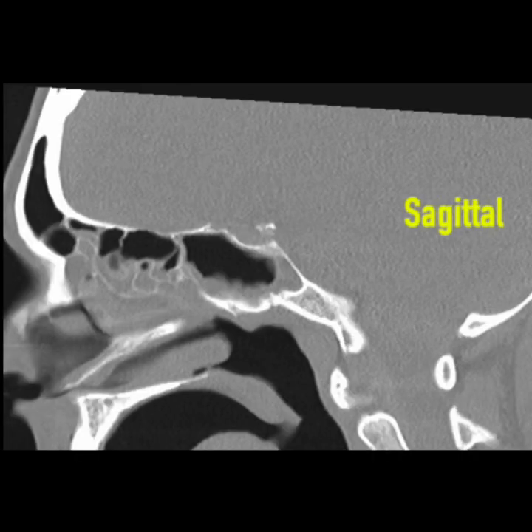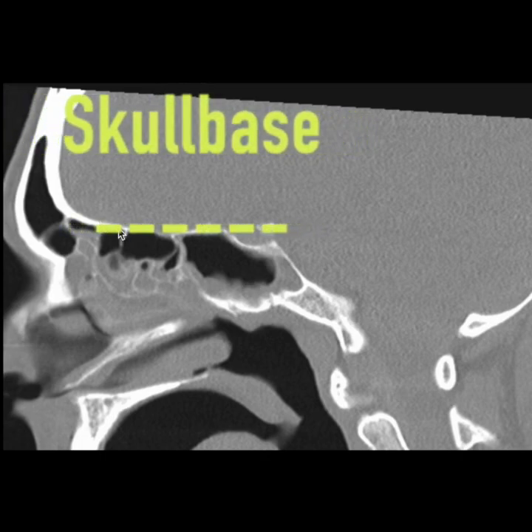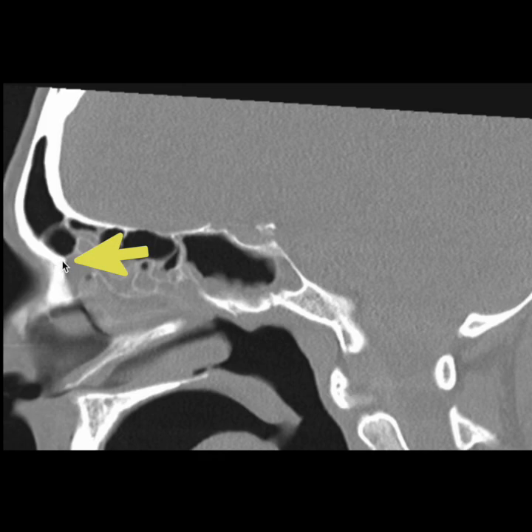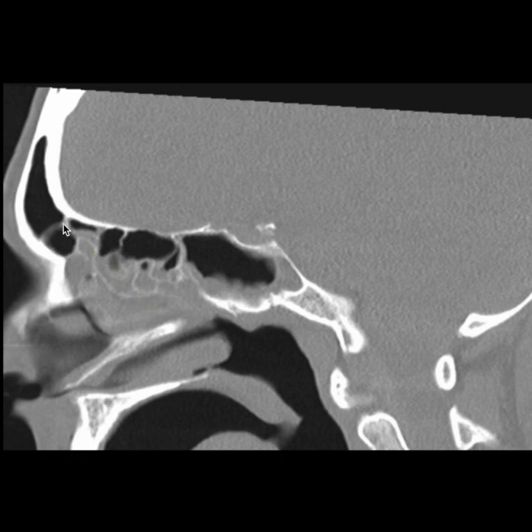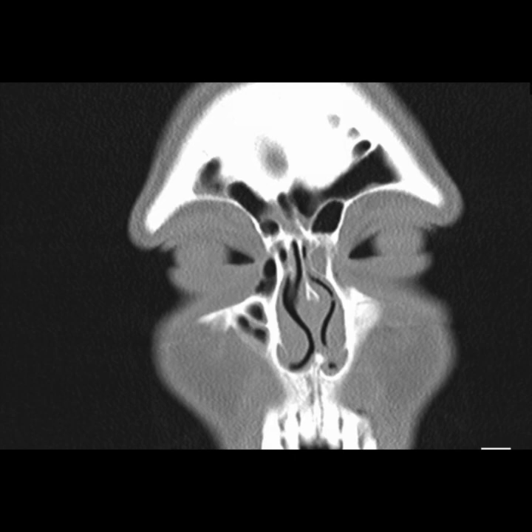This is the sagittal section, which is actually very important when we are doing frontal and sphenoid surgeries. This is the skull base, this is the frontal beak, and lower to that will be your agger nasi cell. The frontal recess will be over here, and can you see this cell? It is the same cell we saw before — and this is a large type 3 Kuhn's cell.